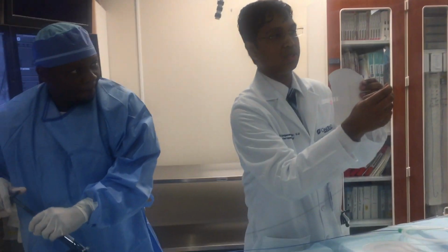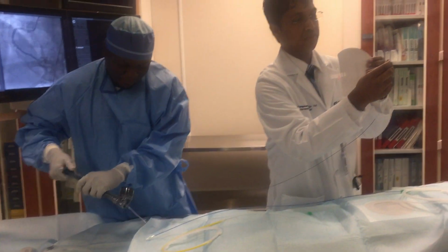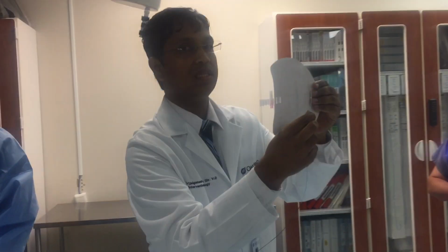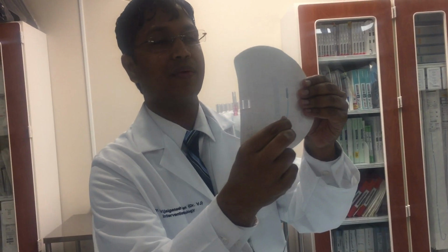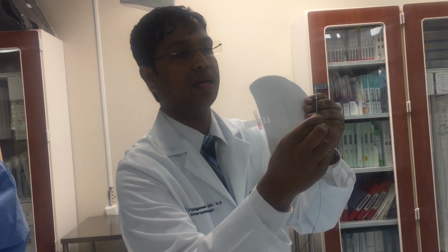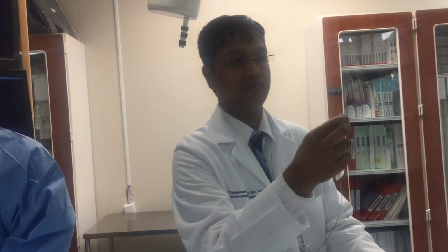So we use a balloon to blow it up. Mike is going to try and show whether we can blow this up. You could see it enlarging. This is what happens within the heart artery. The stent pushes the blockages against the artery wall, and then the balloon can come out. The stent stays within the heart.